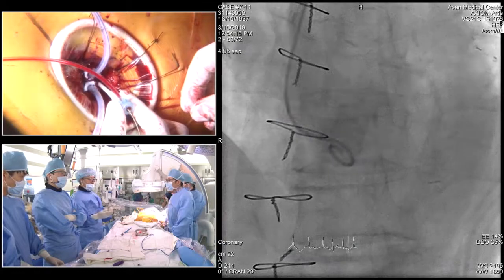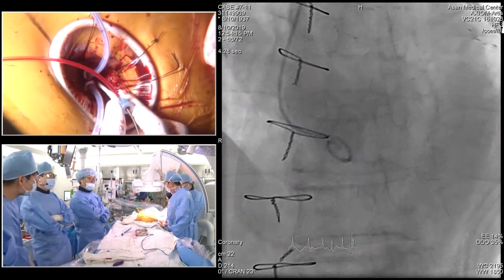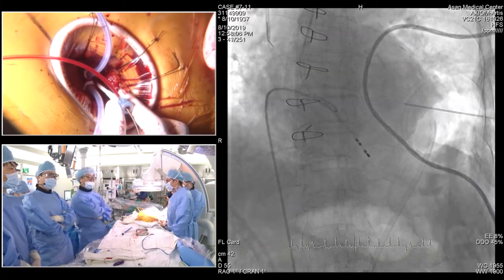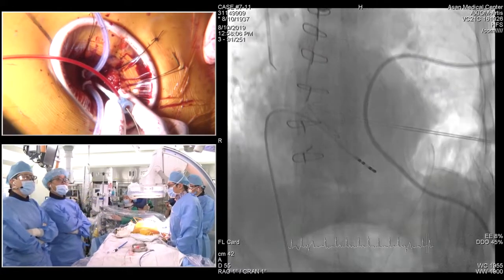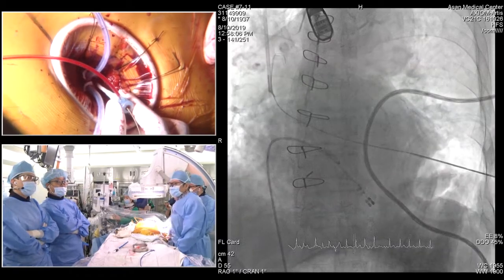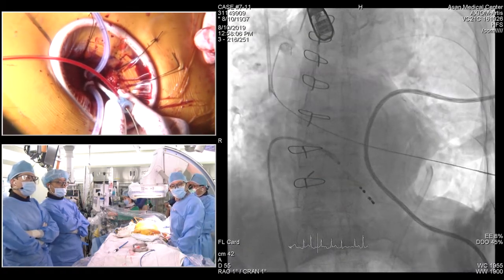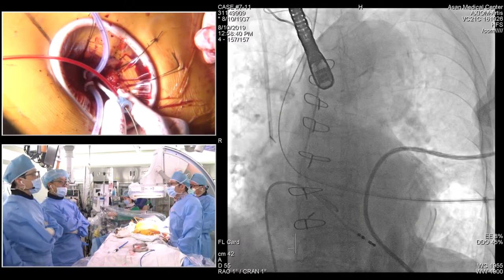Yeah. So, a comment from the panelist. The selection of the transapical approach for this patient was already made, as it is a bypass surgery patient. When I look at the CT image, the main atherosclerosis was distributed to the aortic arch, distal to the right carotid artery. So another option, instead of the transapical, what about the direct ascending aortic approach?